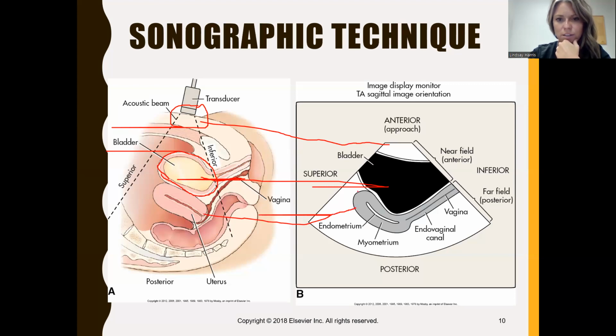When we're measuring the uterus, in the length, you're going to measure from the fundus, which is the top portion of the uterus, which we talked about last chapter, to the cervix. And of course, we're going to have a better line than my squiggly little line there. So that's going to be your length. And then you're going to do an anterior posterior diameter, which is going to be here to here. And this is in a sagittal view. So this is the sagittal view. The sagittal means that the probe is going to be long.